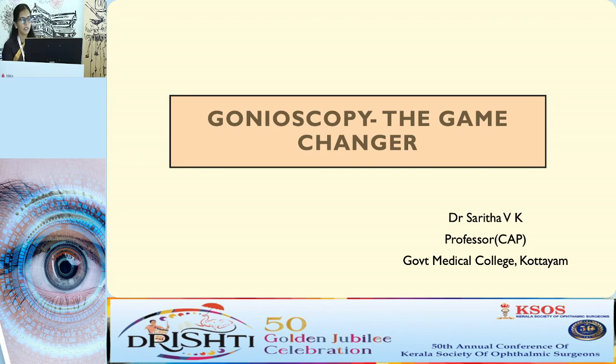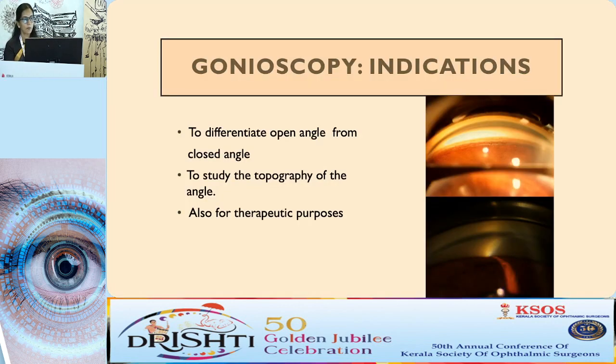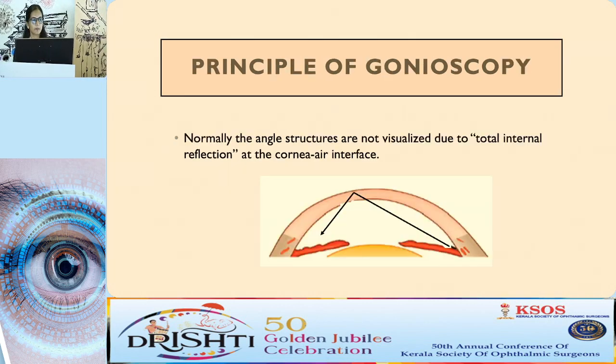The topic is gonioscopy. Straight away coming to the indications. Basically, it is to differentiate an open angle from a closed angle and to study the topography of the angle and also use for therapeutic purposes.